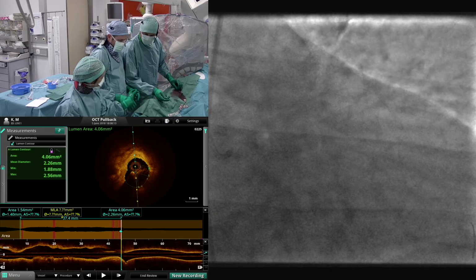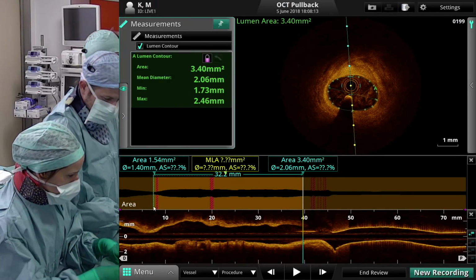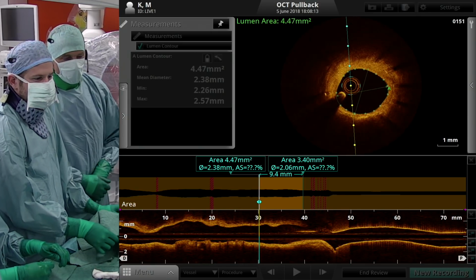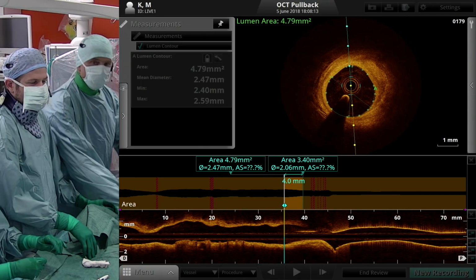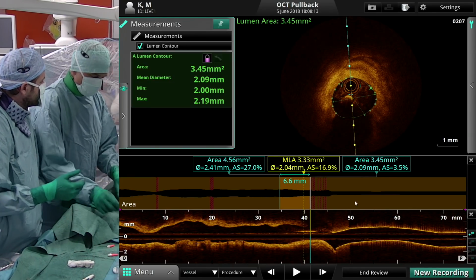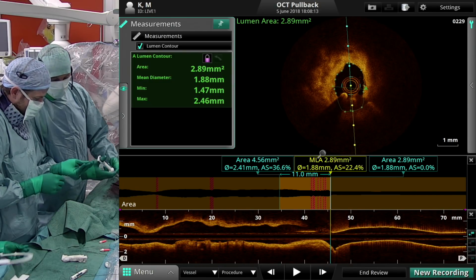So the size of the landing zone of the stent to the proximal LAD. But I think this is more or less a compromise in case of left main imaging. Either you have good quality and good flush, but then you don't see the ostium because you have a well-engaged guide, right? This is back into the guiding, and this is actually the vision in the left main.